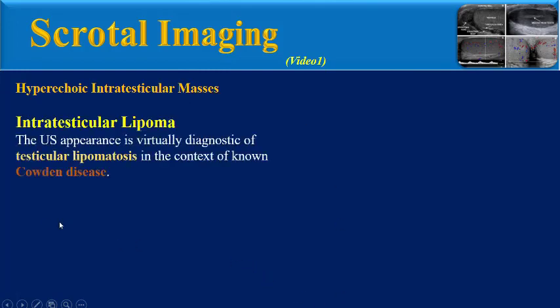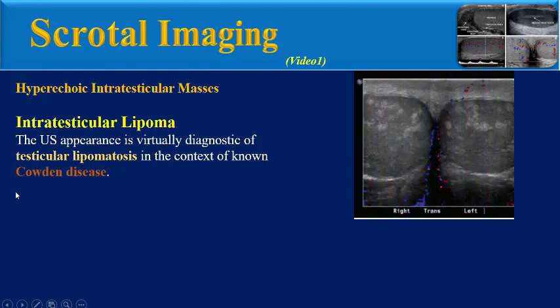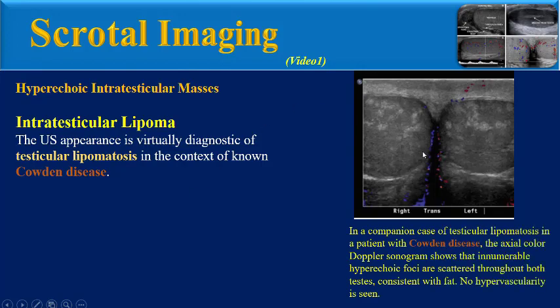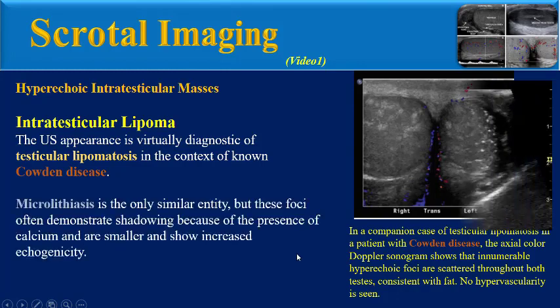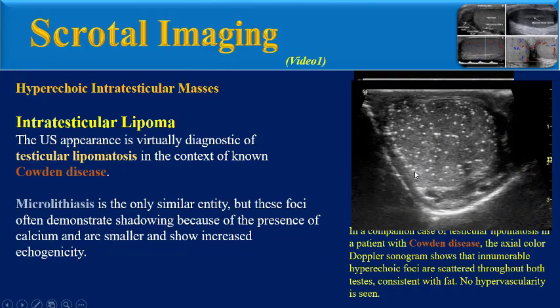Another form of intratesticular lipoma is testicular lipomatosis. The ultrasound appearance is virtually diagnostic of testicular lipomatosis in the context of known Cowden disease. This axial color Doppler ultrasound shows innumerable hyperechoic foci scattered throughout both testes, consistent with fat. Microlithiasis is the only similar entity, but those foci often demonstrate shadowing due to calcium and are smaller with increased echogenicity.